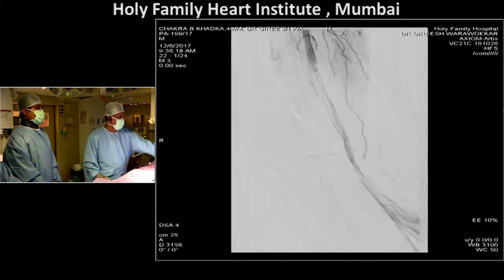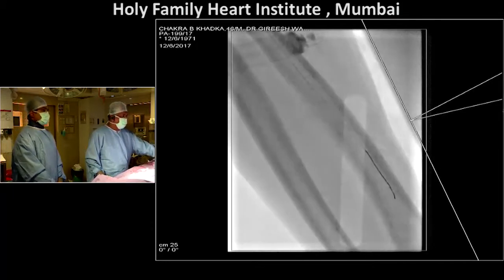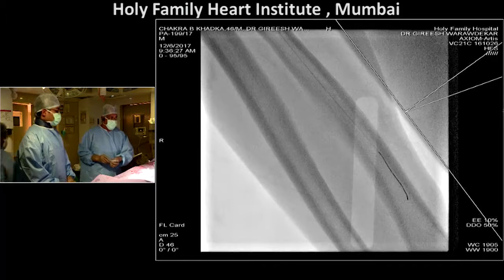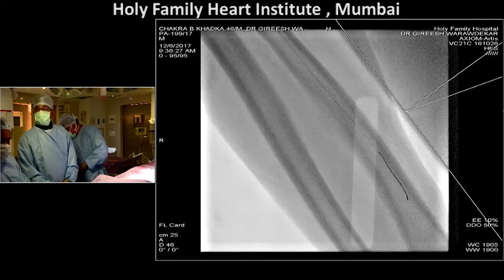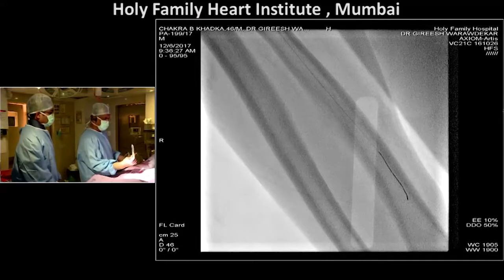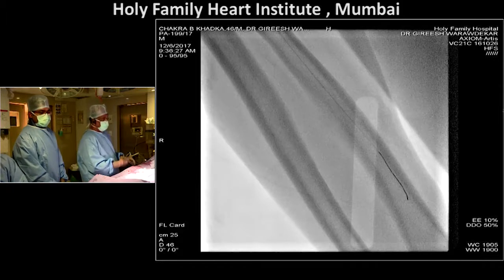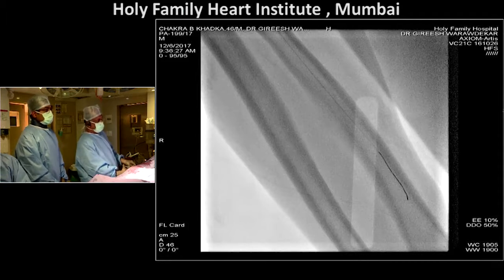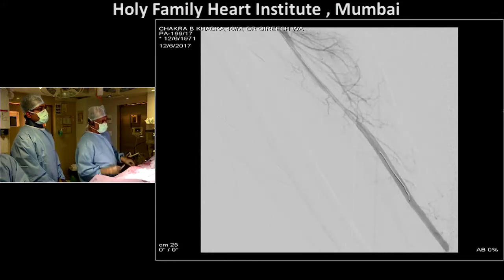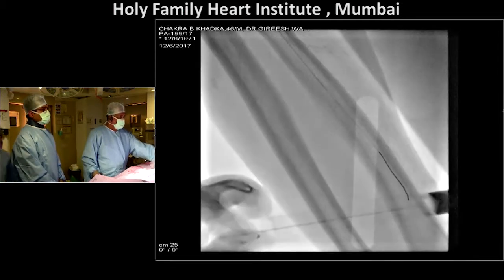Looking definitely a little better there. Just a little spasm distally there. There is a little stasis basically, because I've got a 7 French sheath in the brachial. So that may be causing the little stasis. Right. But otherwise the flow looks okay. This 7 French sheath, do you have the Shuttle, or which one do you have here? Yeah, I've got the Bright Tip of Cordis. Okay. This is a long segment of spasm, I'm sure. Yeah.